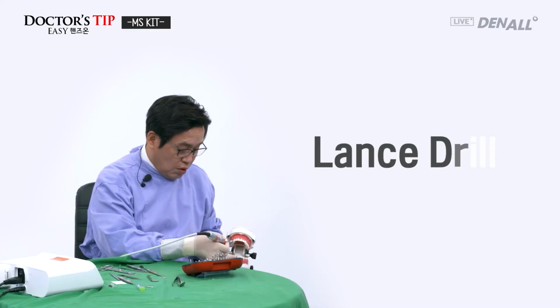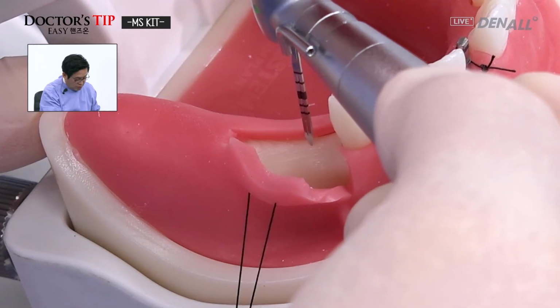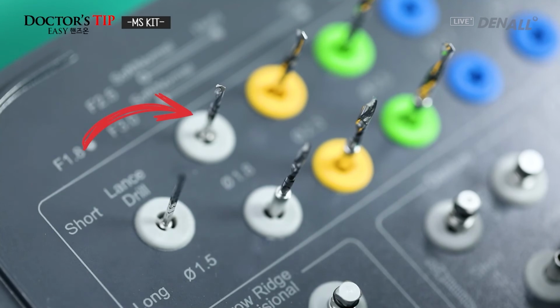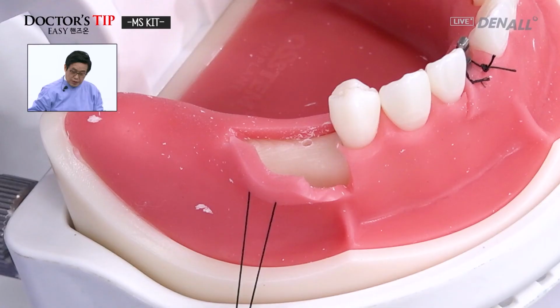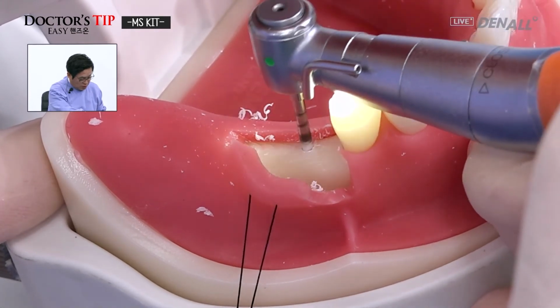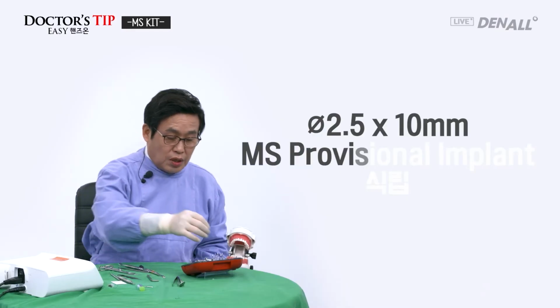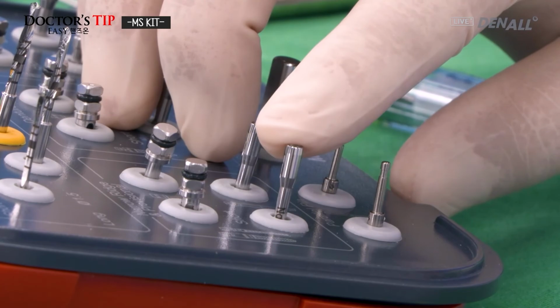Lance drill is used. So after placing implants, I have to put in provisional, temporary. So I will show you how it's bent. 1.8 diameter twist drill is used. RPM 1200, like this. So positioning intentionally this way to show you bending. And provisional MS implant 2.5, 10 millimeters, no mount driver, short type.